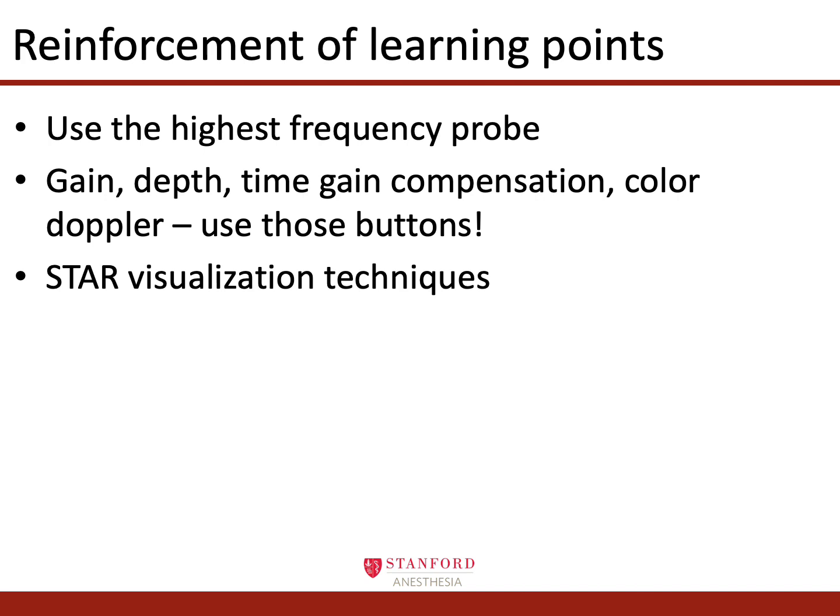Just to go over our learning points: use the highest frequency probe possible when imaging your target. Use the gain, the depth, the time gain compensation, and the color Doppler. Those buttons will make your needling safe, effective, and optimized. And seek out and read the star visualization technique.